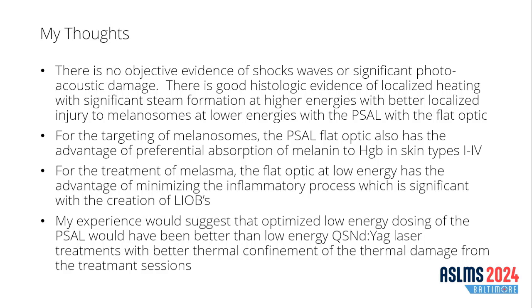For melasma, in my opinion, the flat optic at low energy is the way I treat these days, and it minimizes the inflammatory response, which can be significant. So my experience would again suggest that we should be doing low energy picosecond alexandrite treatment for this condition. And had it been done in this study, my assumption was we would have been significantly better than the Q-switched device that was used. Thank you.